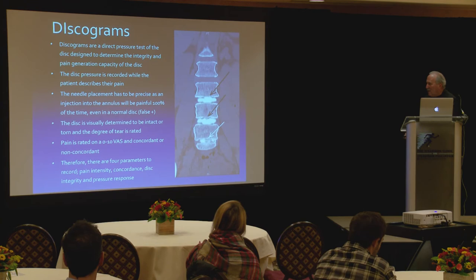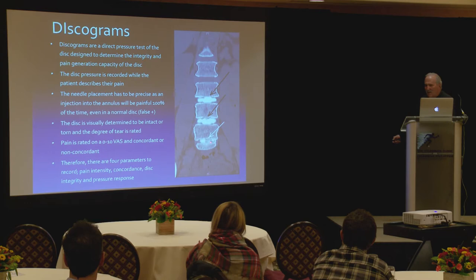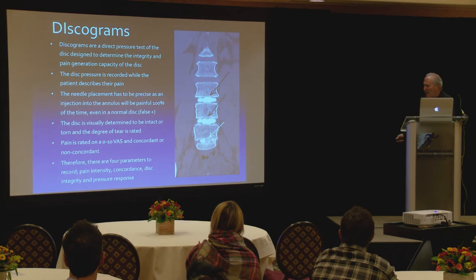Discograms. Discograms can be wonderful, can be problematic. So this is the old days when I had Dr. Evans do a discogram probably some 10, 12 years ago. And discograms are valuable tools to determine pain. So let's go to the next slide.